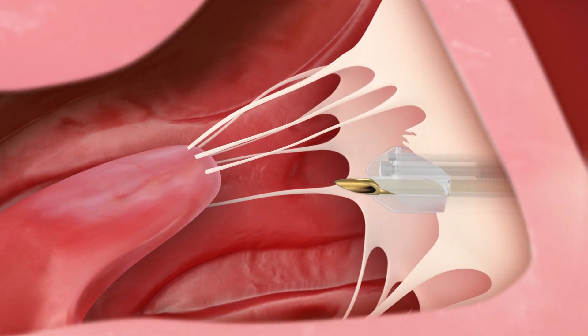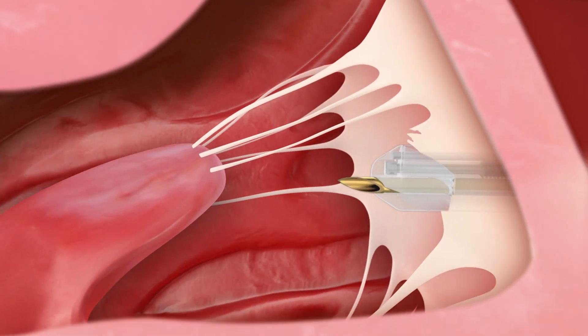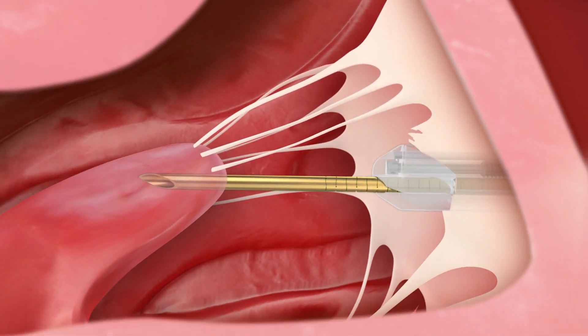The integrated needle punctures the leaflet. When the needle has been successfully guided towards the papillary muscle, the muscle is also punctured.